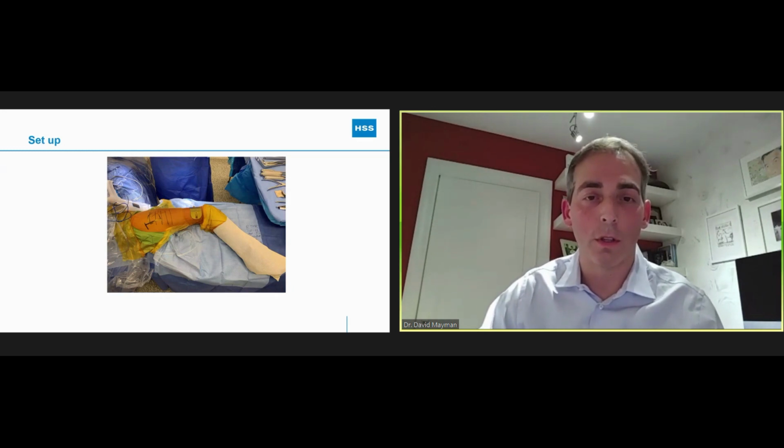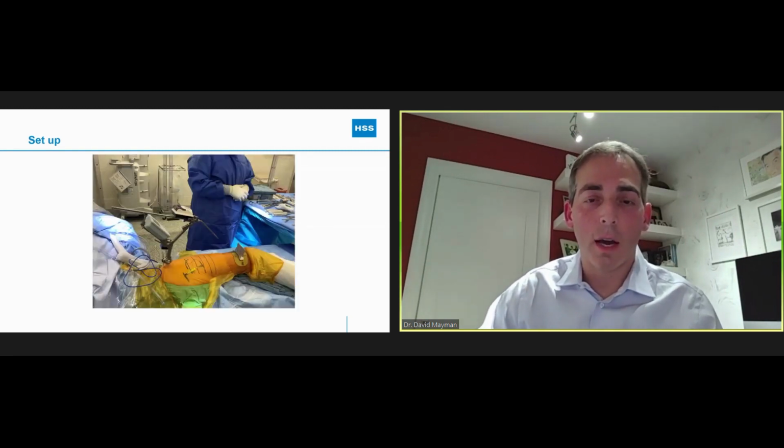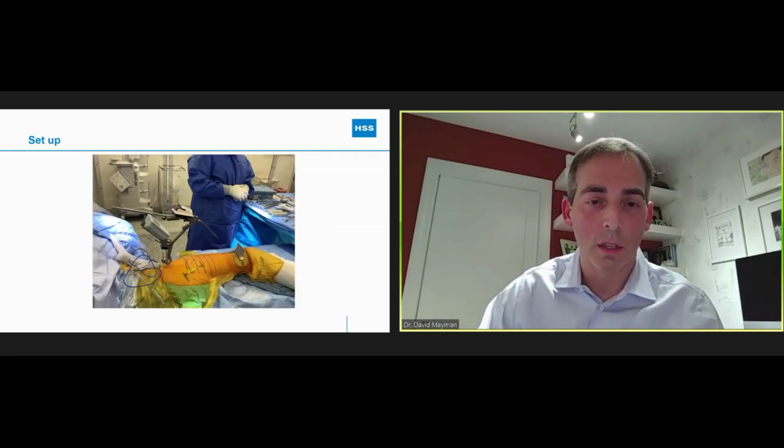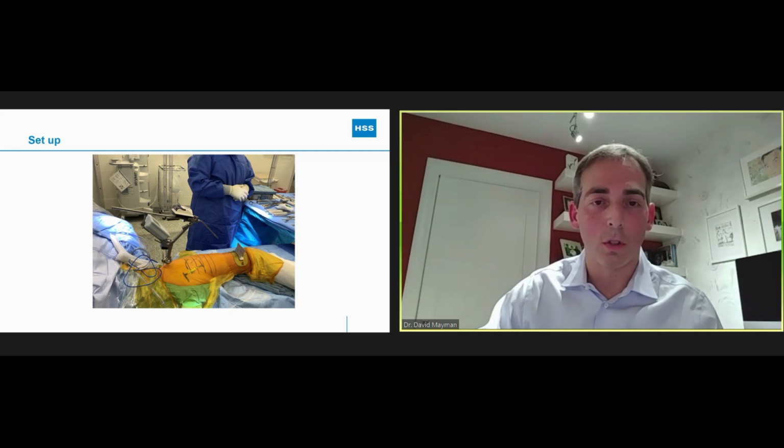If you look close, there's actually a plate, it's just an ioband that's holding this on the leg here. You'll see why we have that in a second. And then I've drawn out my incision just off the back corner of the greater trochanter. So 2 vertical pins go into the iliac crest to hold the device in place. There's a clamp that goes onto those 2 pins. And then the accelerometer-based system is here.